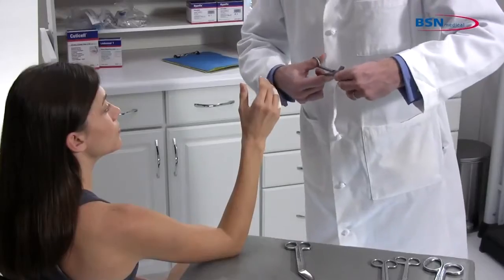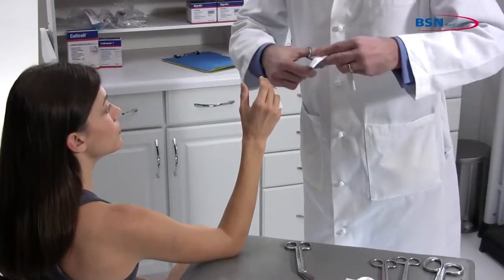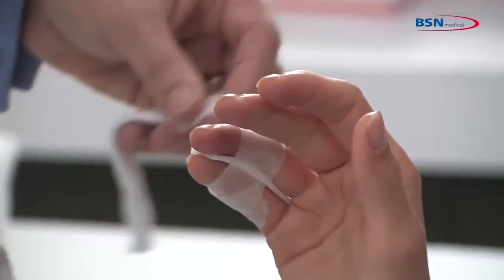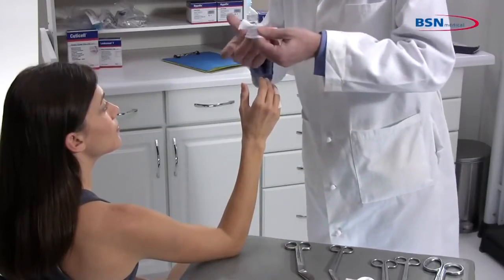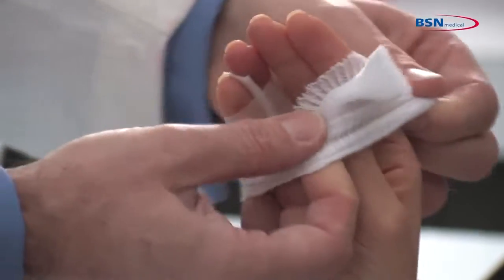Measure with a one-inch stockinette length to protect the thumb area. Make a one-half-inch cut at one-third of the length. Slide the stockinette over the wrist and apply the other part over the thumb for protection.